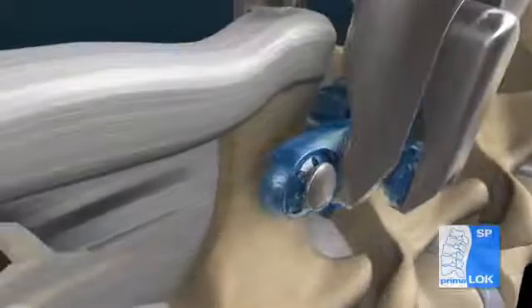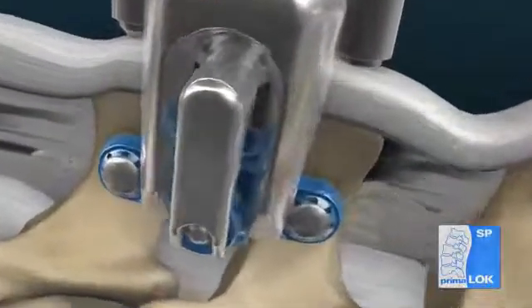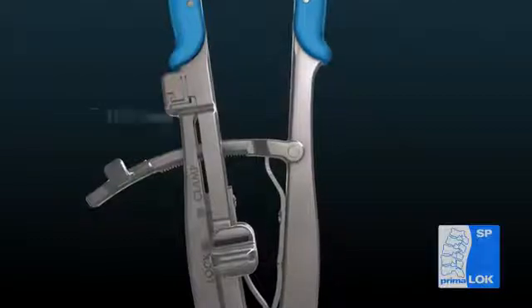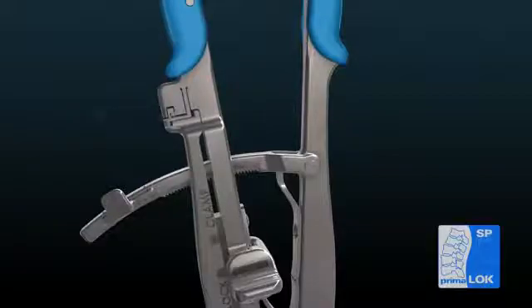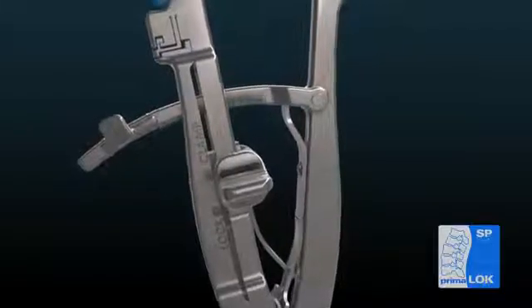Confirm that each polyaxial grip has seated into the spinous process and locked out, having no motion. Place the slider tab into the lock position. With the implant seated, provisionally lock the PrimaLoc SP into position by squeezing the inserter until an audible click is heard. Place the slider tab back into the clamp position and release the ratchet arm.